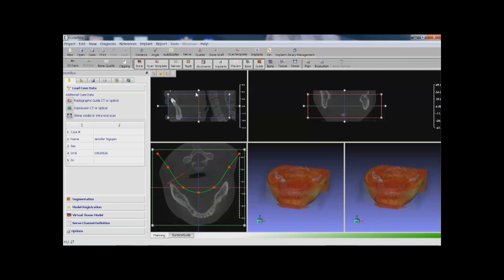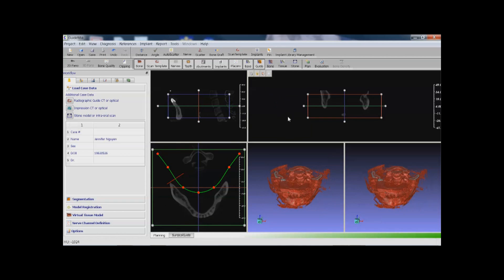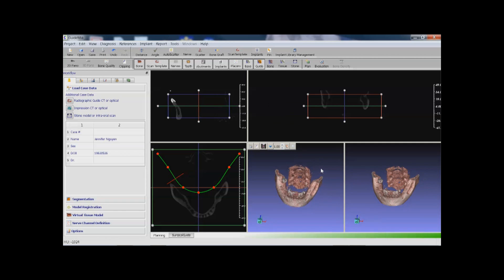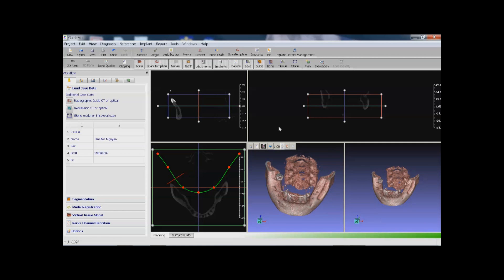Once the patient data is loaded, you can adjust the thresholding in 2D slices to inspect the patient's scan and 3D rendering. You can change the display to color mode, bone quality mode, and you can clip the model as well.